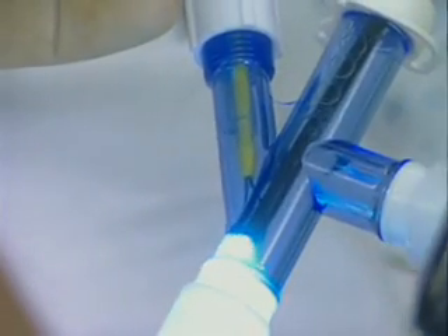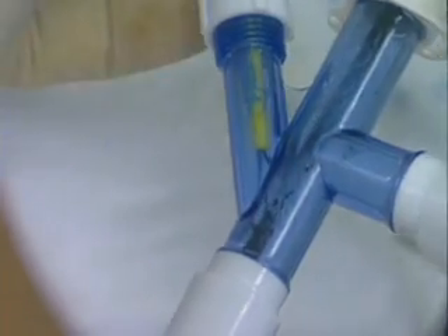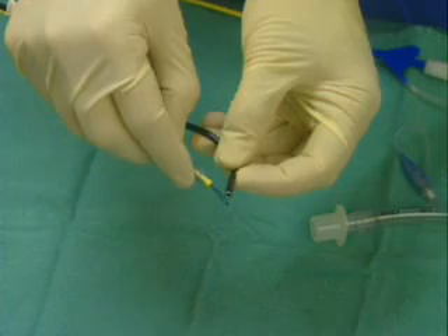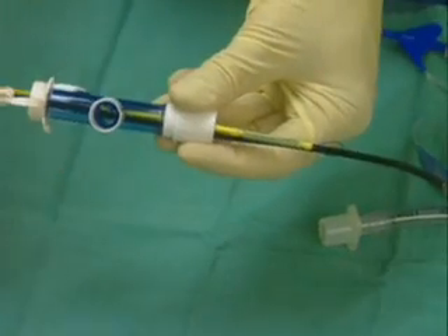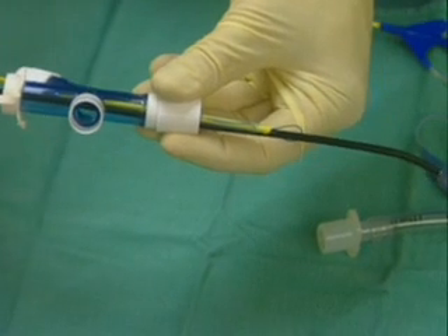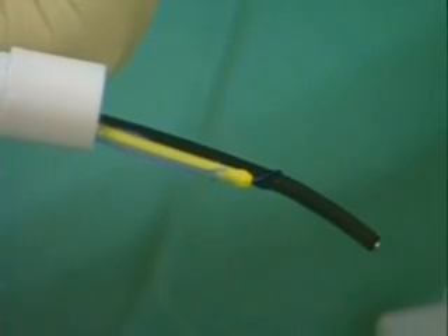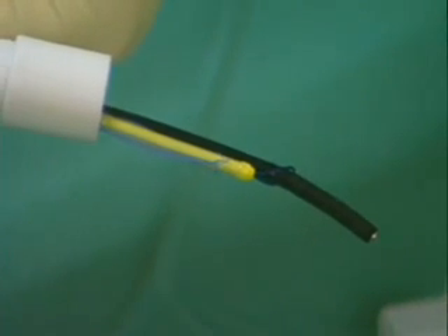A pediatric fiber optic bronchoscope is advanced through the guide loop to couple the bronchoscope and the endobronchial blocker together. This may be done within the multiport adapter, endotracheal tube, or within the trachea proper. The endobronchial blocker and bronchoscope may also be coupled together prior to attachment of the multiport adapter to the endotracheal tube. This coupling allows the endobronchial blocker to follow the bronchoscope, and the guide loop can be adjusted to facilitate proper approximation.